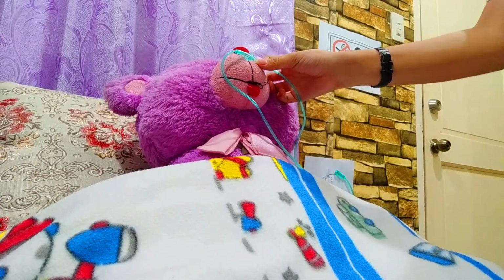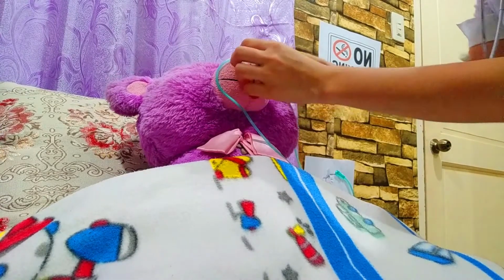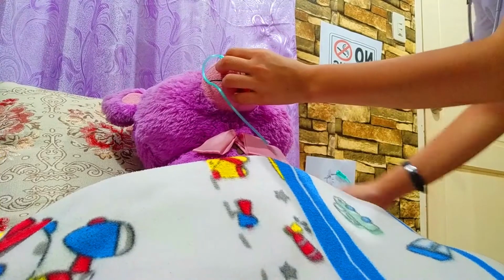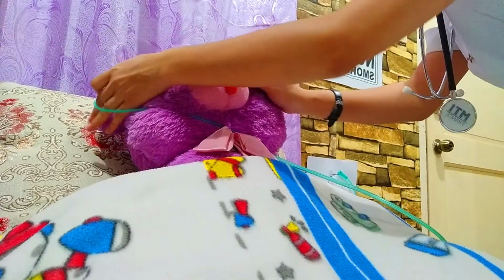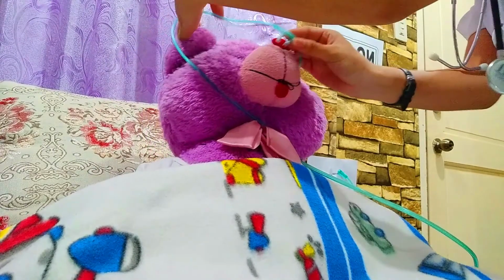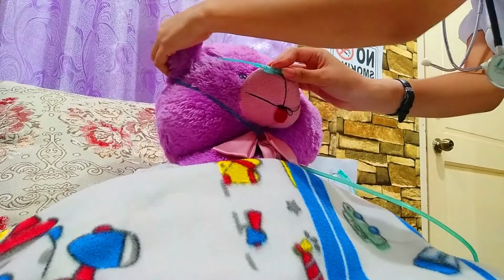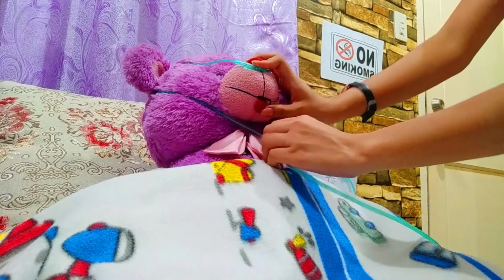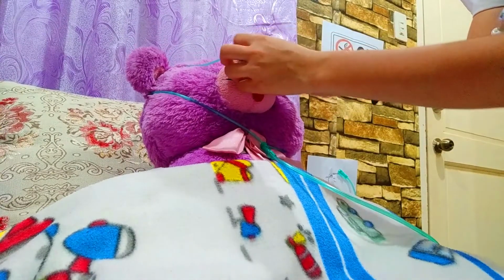And then we need to slip the attached tubing around the patient's ear and under the chin. Here, and here. And then we need to tighten the tubing to secure the cannula.